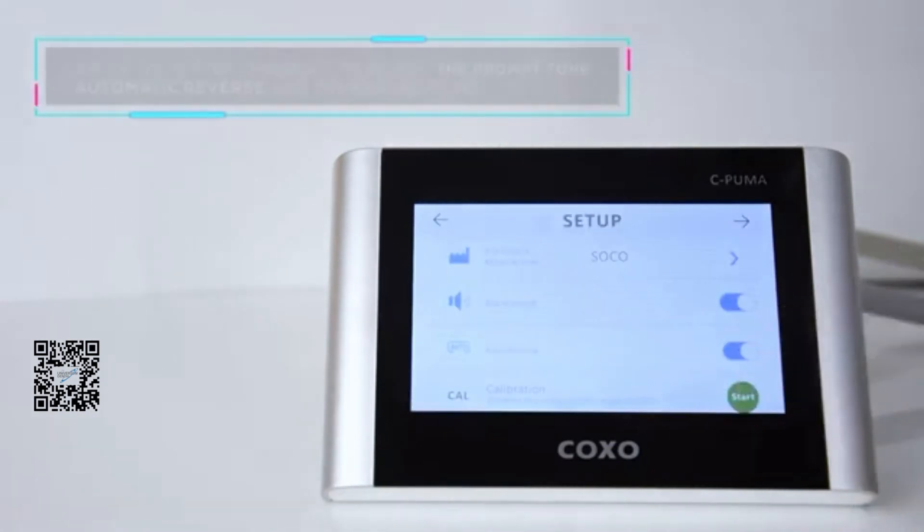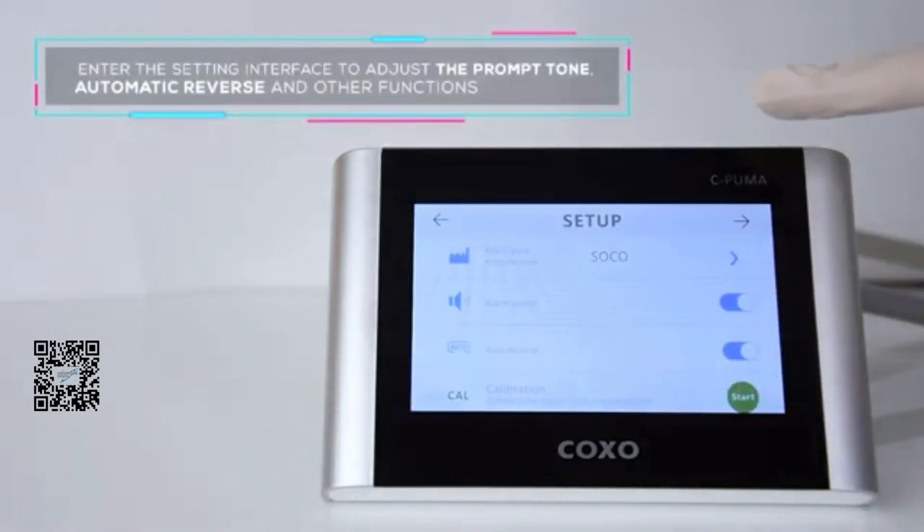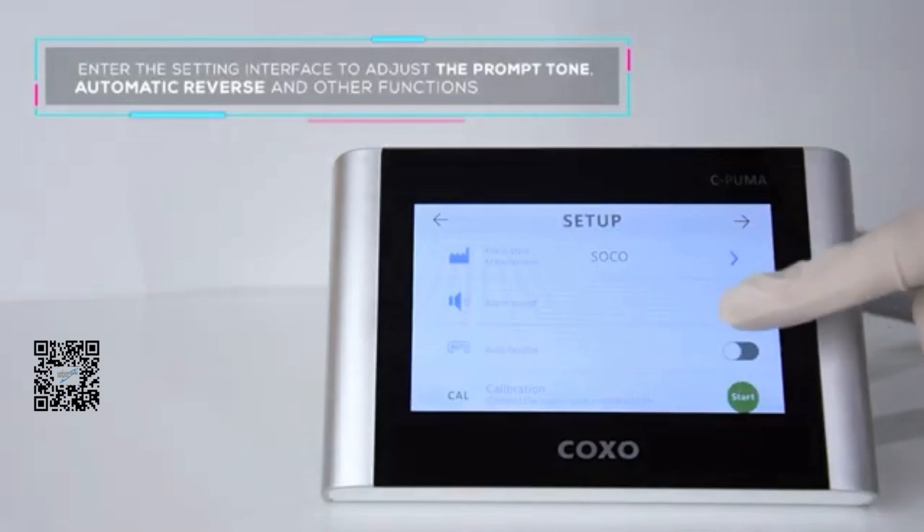Enter the setting interface to adjust the prompt tone, automatic reverse, and other functions.